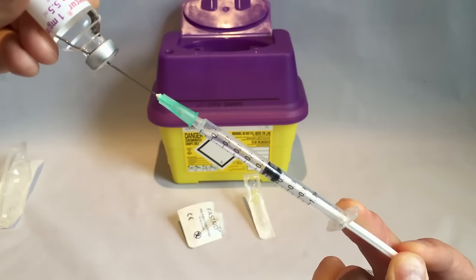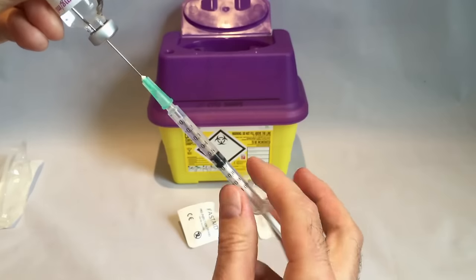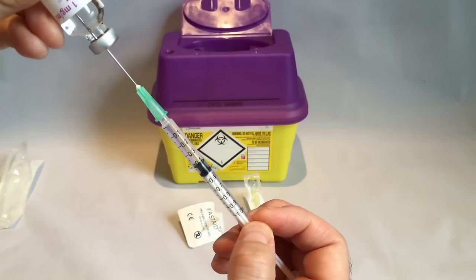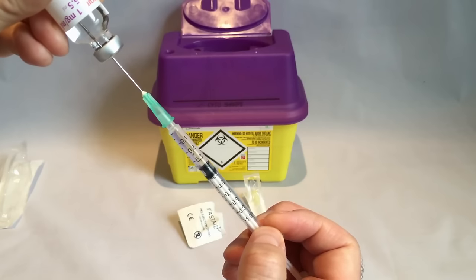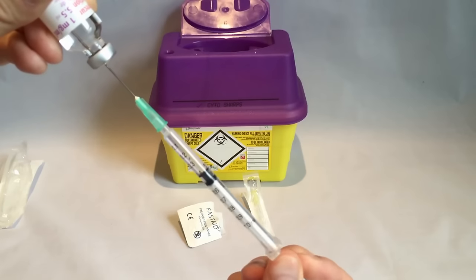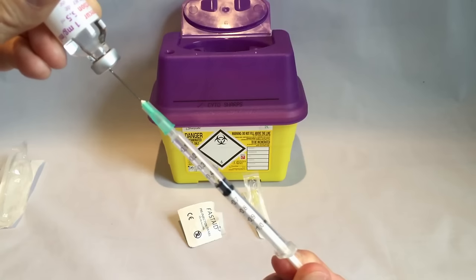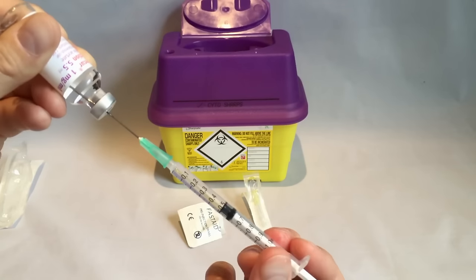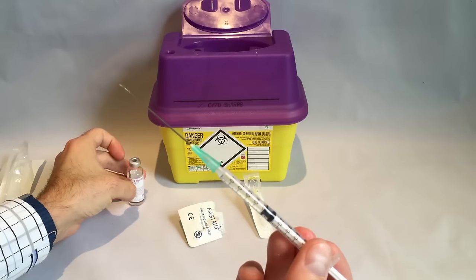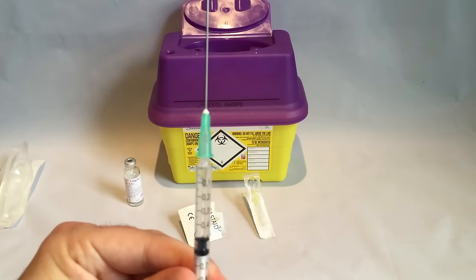At this stage you may find you get some air in the syringe. This is not a problem although you do want to get rid of it. To do this, gently flick the syringe to get the air bubble to the top and push the air back into the bottle. You may need to repeat this a few times to make sure all the air is out. Continue to draw out the liquid until you get the amount you need — in this video we are drawing out 0.5 mils. Once you have the amount you require and there are no air bubbles in the syringe, remove the needle from the bottle.